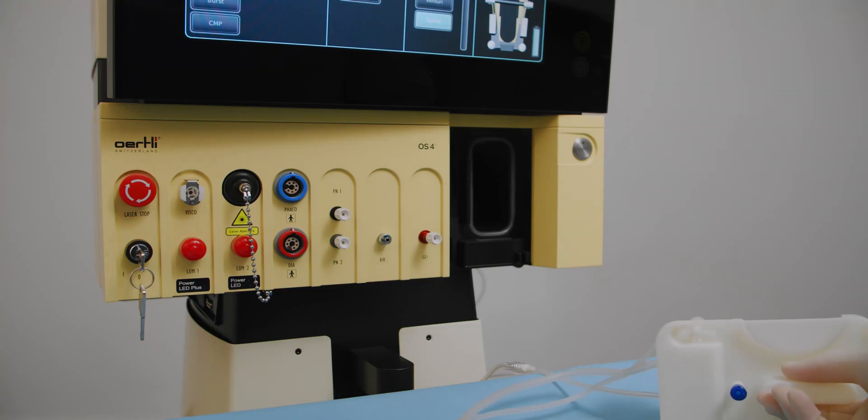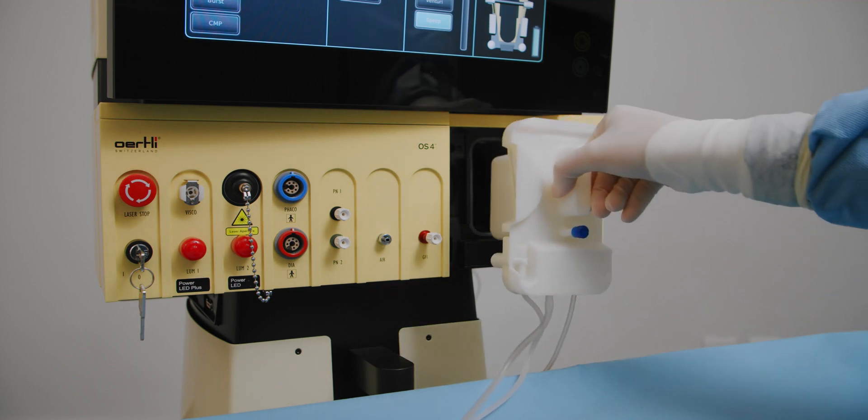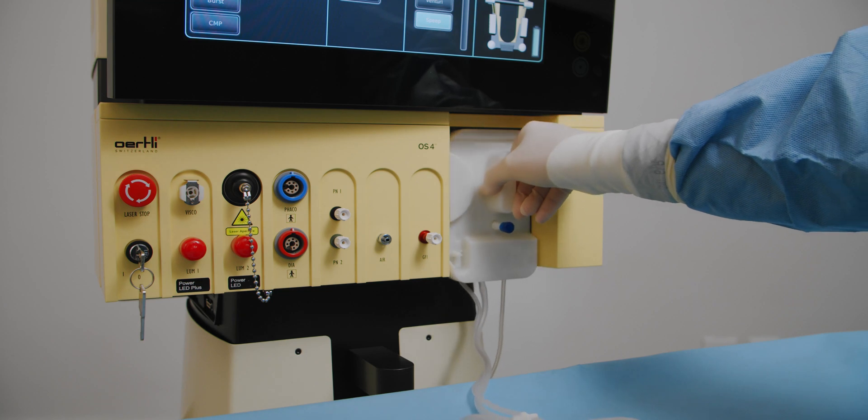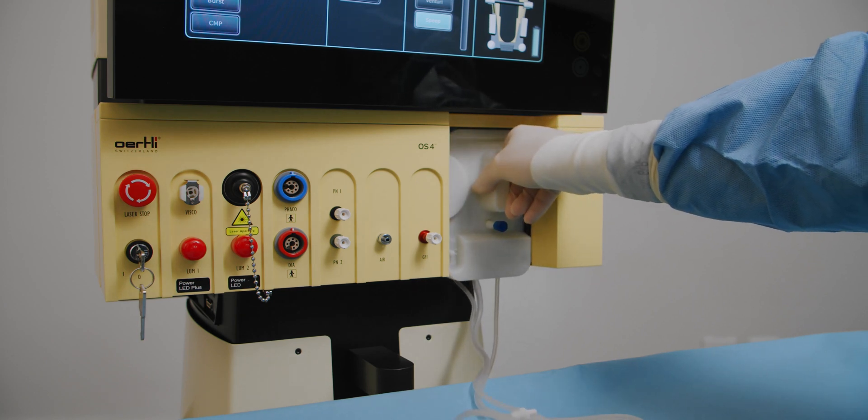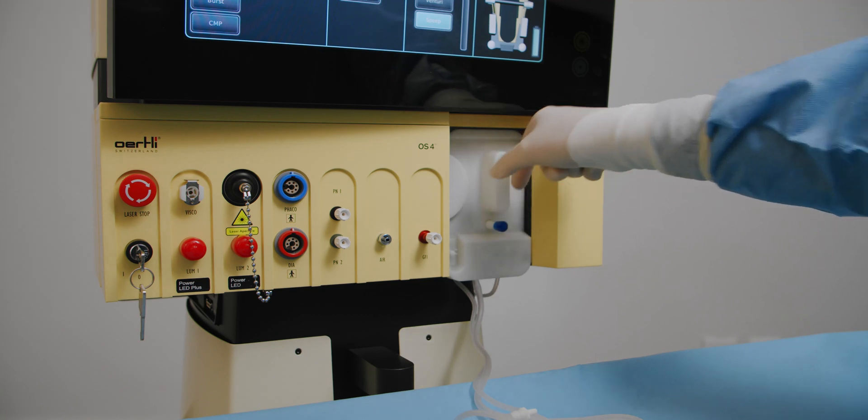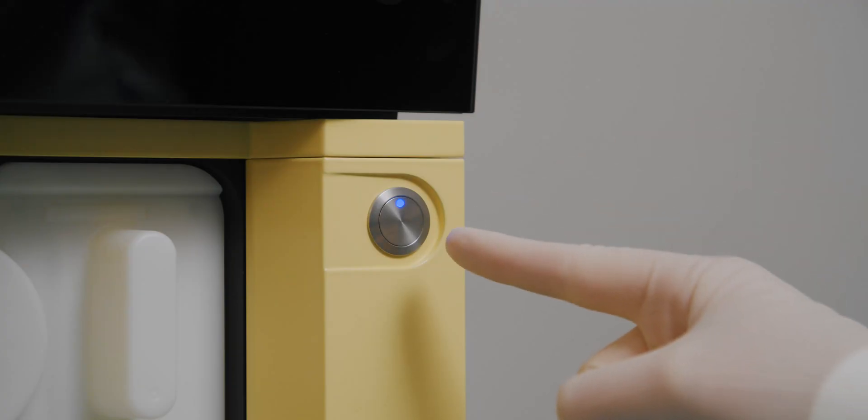Insert the OS 4 cassette into the cassette slot. Push the cassette with the tubes pointing downwards into the cassette slot as far as it will go. The cassette will be automatically pulled in. Once inserted, ensure the light is blue.